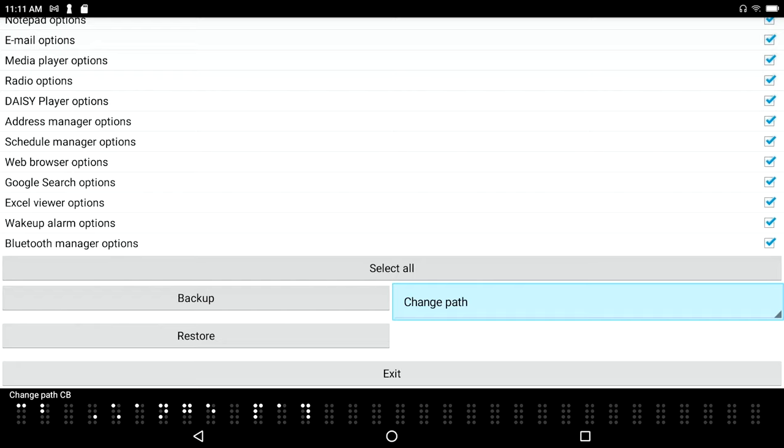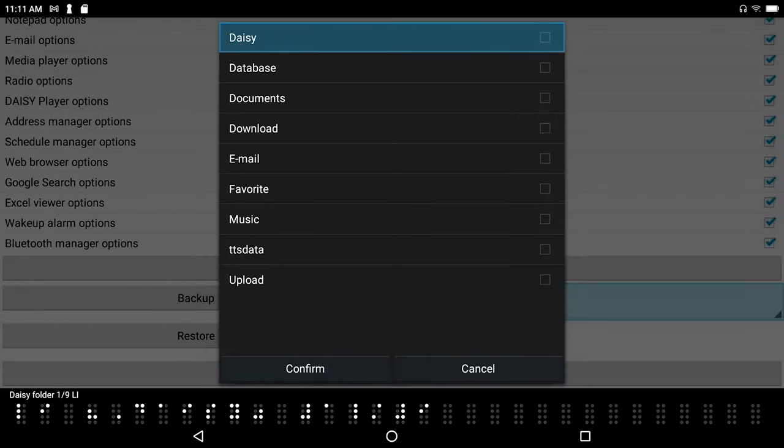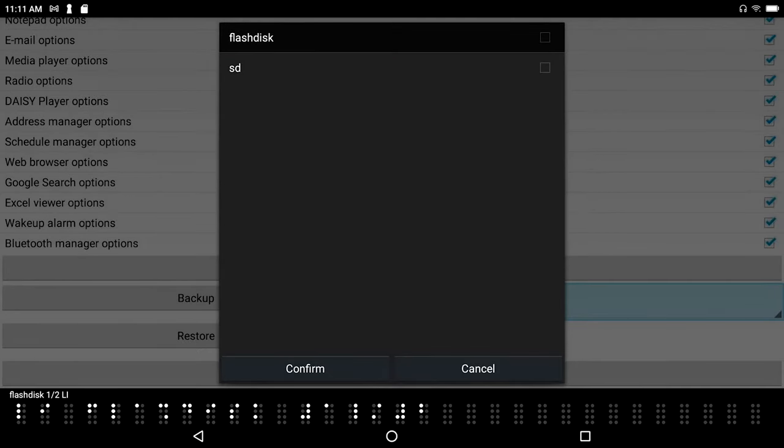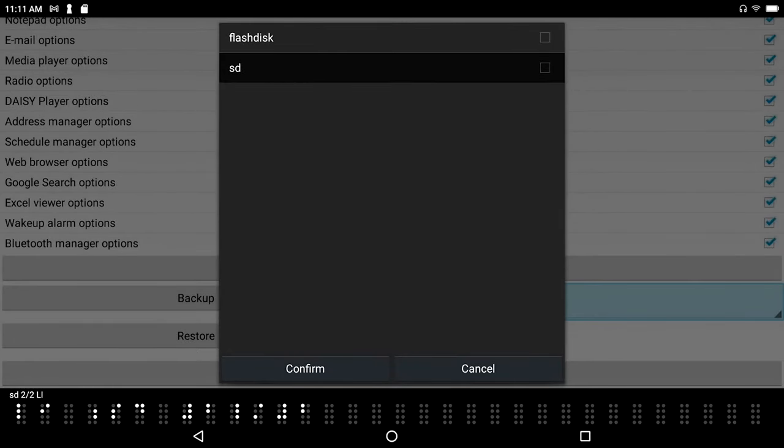Select backup folder dialog, daisy folder 1 on list item. Now I'm going to press backspace. Flash disk 1 of 2 list item, there's my flash disk. SD 2 of 2 list item, there's my SD card.